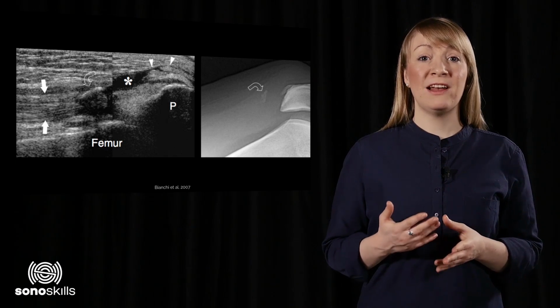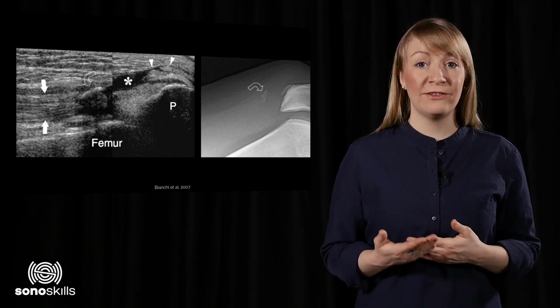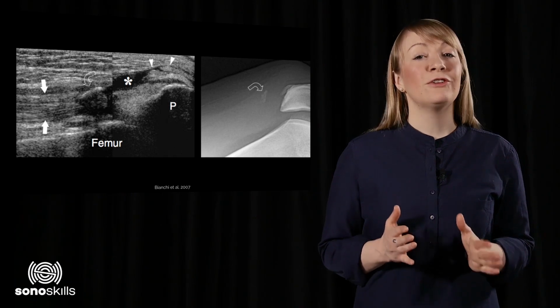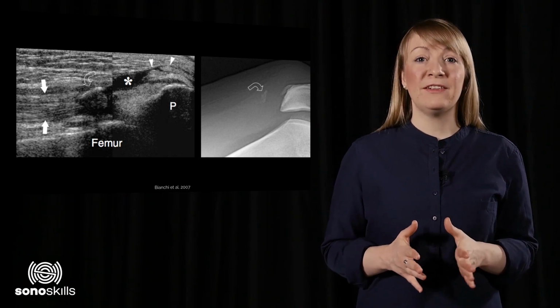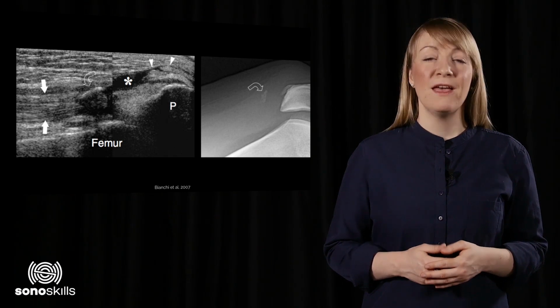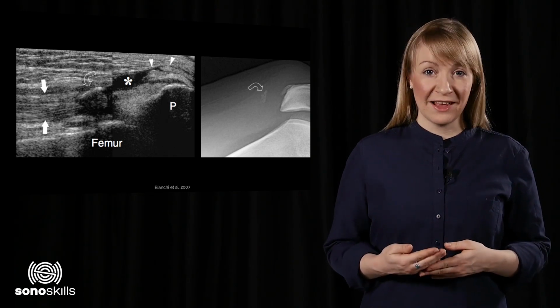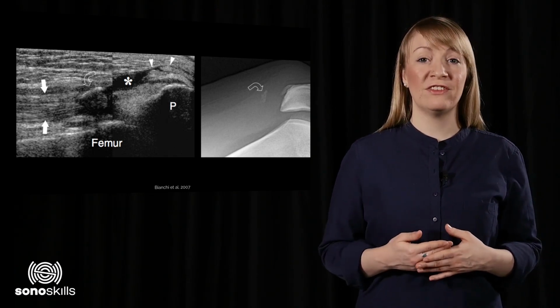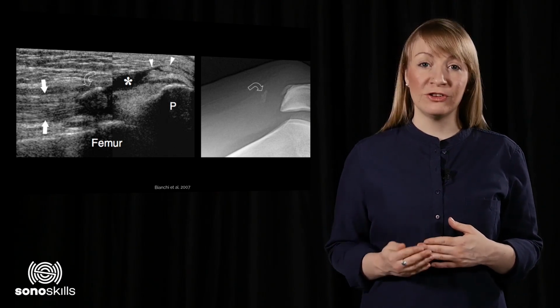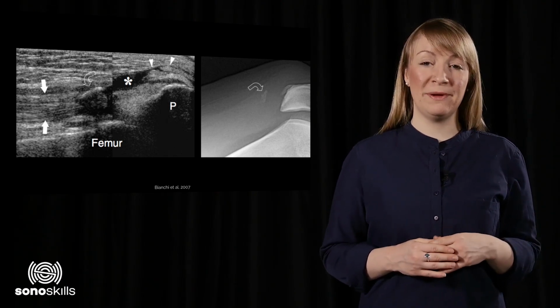Fluids of the suprapatellar recess have migrated superficially through the complete tear. This conclusion should be confirmed by scanning both longitudinally and transversely. Measurements of the tear size and suprapatellar recess dimensions have to be made to accurately document the pathology for diagnostic and/or evaluative purposes.